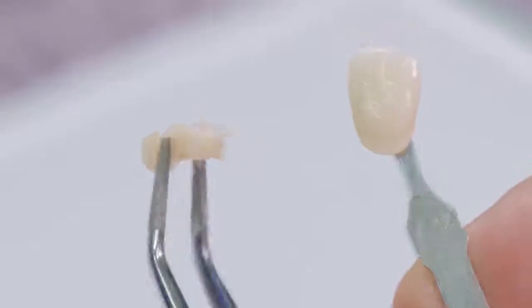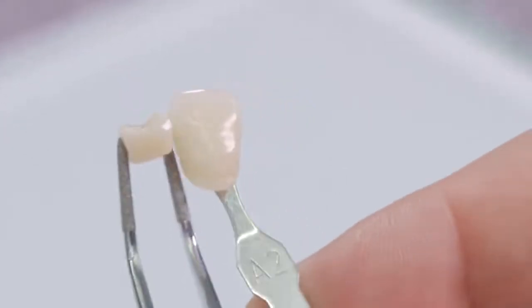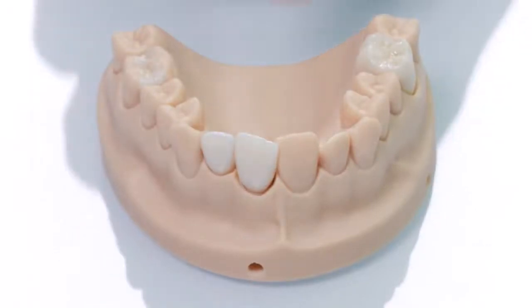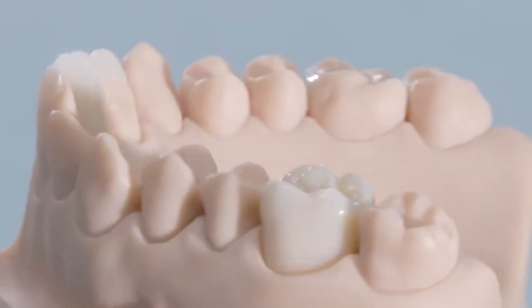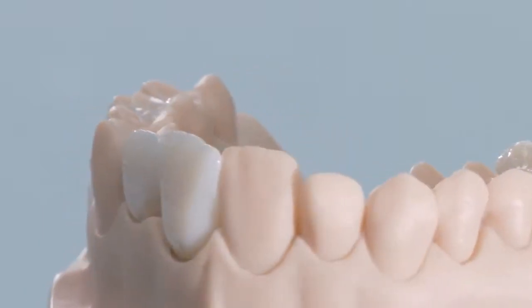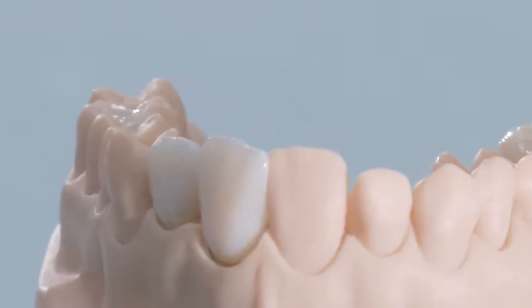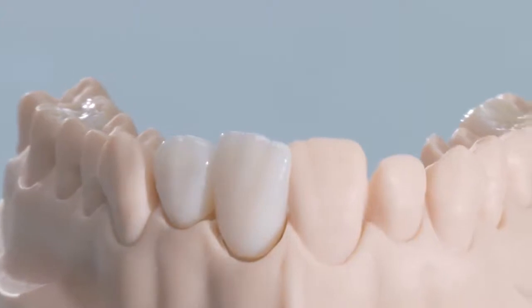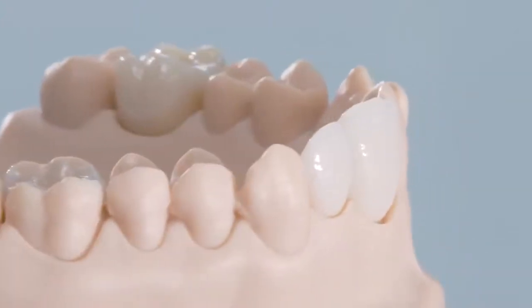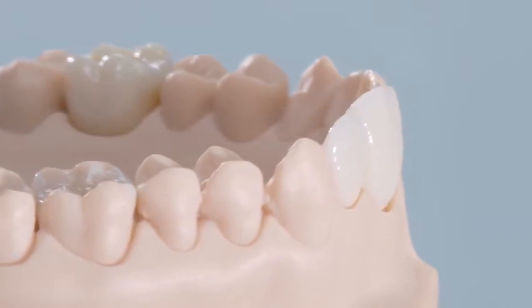The result is convincing — a restoration that perfectly matches the desired target shade. Depending on the desired indication or design, you can easily create high quality ceramic restorations with Cerec Ticera in a flexible, reliable, and quick way, and all this with maximum stability and convincing shade reliability.